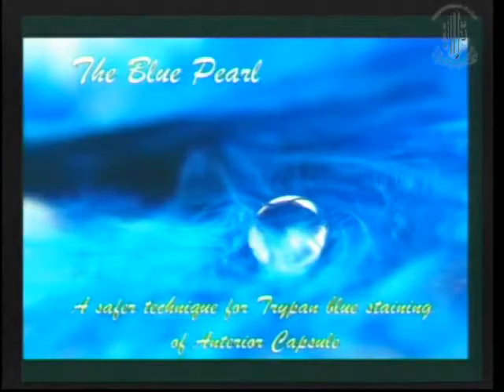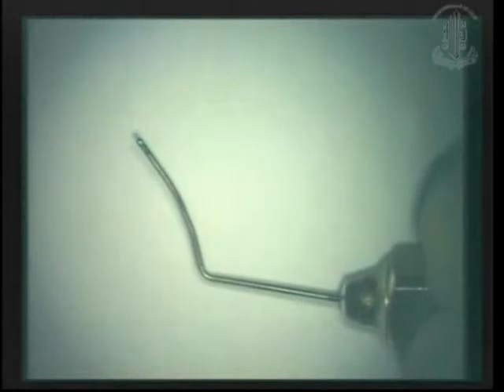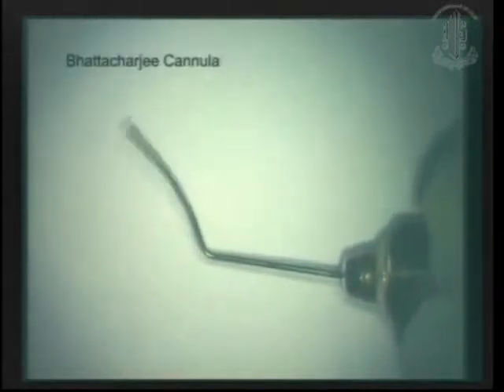So, a little pearl, for those who are still using trypan blue under air, maybe you could switch over to this. It's very easy to use the same cannula also, but what I've done is I've just modified a Fogla cannula, which is used in DALK, a wonderful invention by Rajesh Fogla. It's got an anterior vault. We just added one more hole, a bottom hole, and now this takes care of the trypan blue to be stained on the capsule. It's got a blunted tip, an anterior vault, so aligning to the capsule curvature. So that's how the trypan blue would escape.